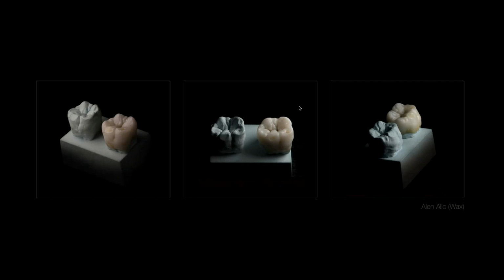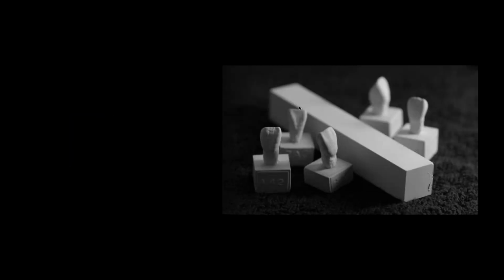Here you can see the edges of the tooth, the space, the shadows, the lights, and how we place this tooth in the same position as the tooth that we copy. And later you will see what the next exercise is.